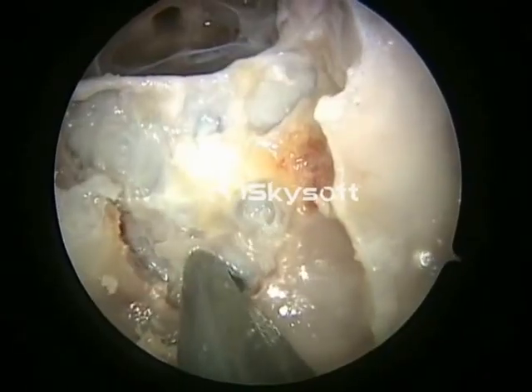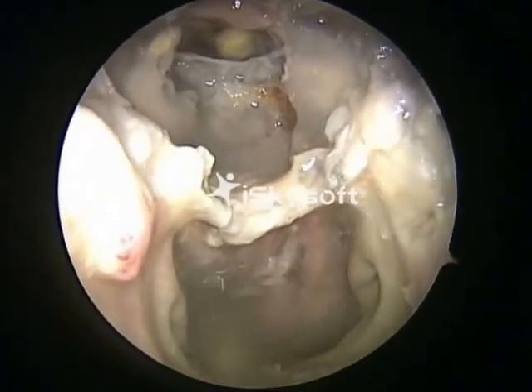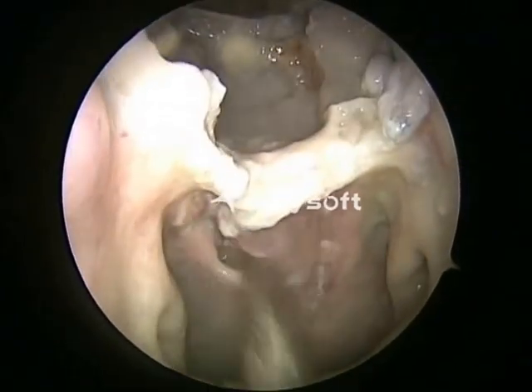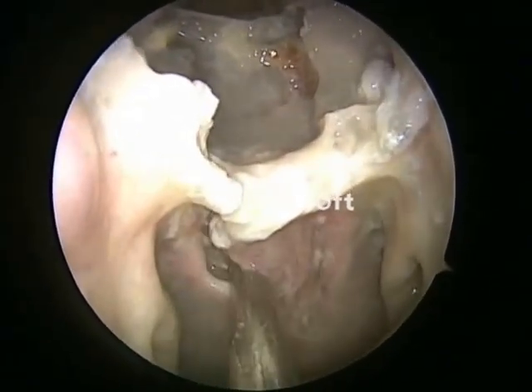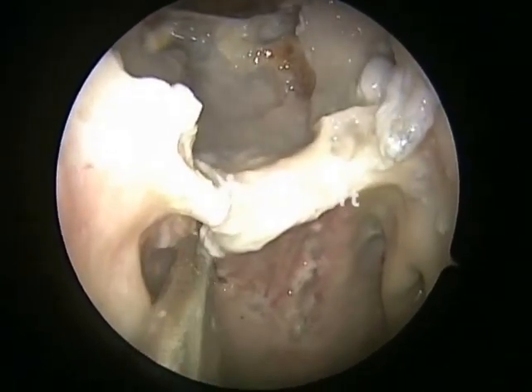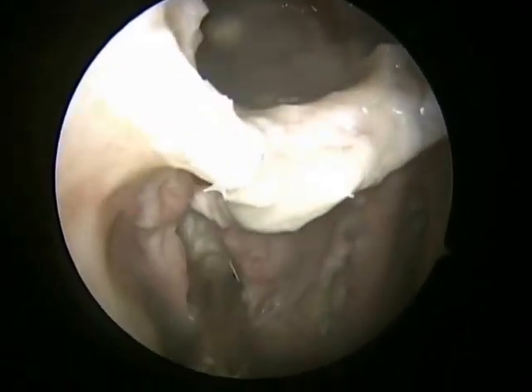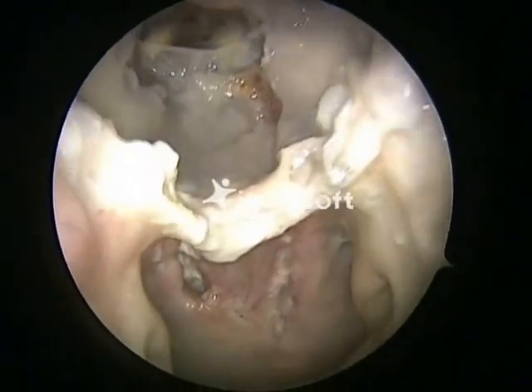We have to remove the bone till the floor of the sphenoid sinus, and that is removal of the soft tissue of the nasopharynx, the pharyngobasilar fascia, the longus capitis, longus colli muscles.